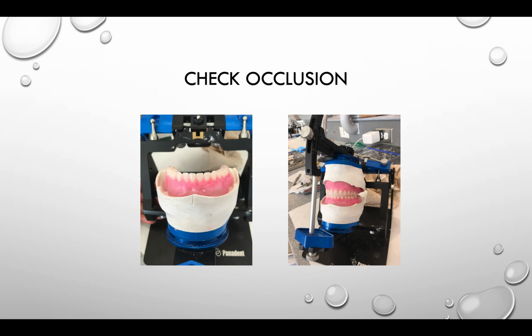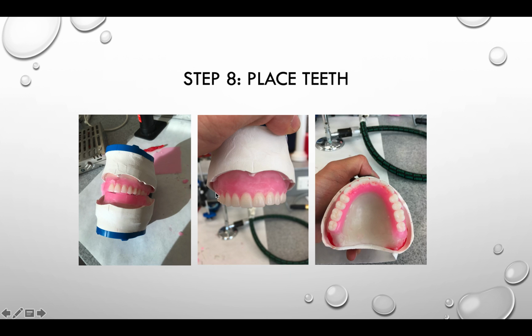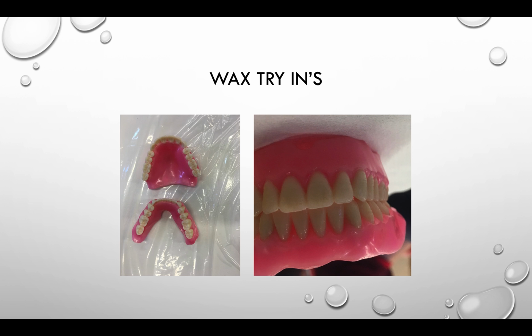That takes us to the next step. Once you get all the teeth in, you're going to check occlusion, make sure that the occlusion is just right, and then you're going to try the actual teeth in the patient, but that is still wax, believe it or not. These are the wax try-ins that Dr. Durham showed us the lab did. Compare that to mine, which don't look nearly as good, and so I'm glad that the lab techs with their expertise can do this for us.